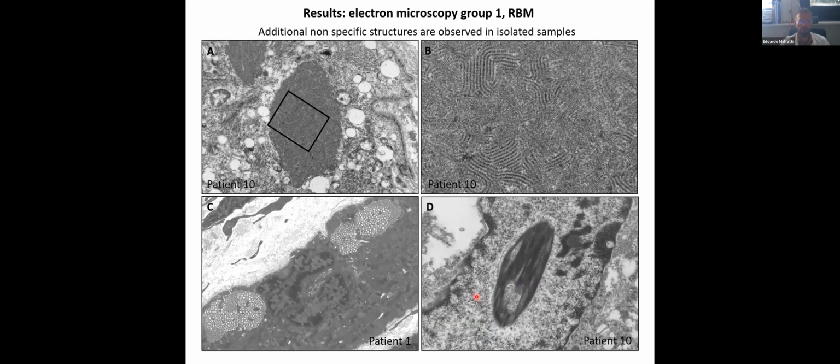staining. Moreover, we could disclose a lot of different structures associated with the reducing body and the cytoplasmic body. Here you can see a fingerprint body, composed of material that is orientated like a fingerprint. We also found tubular aggregates associated with, and in proximity of, the nuclei of the disrupted fiber.